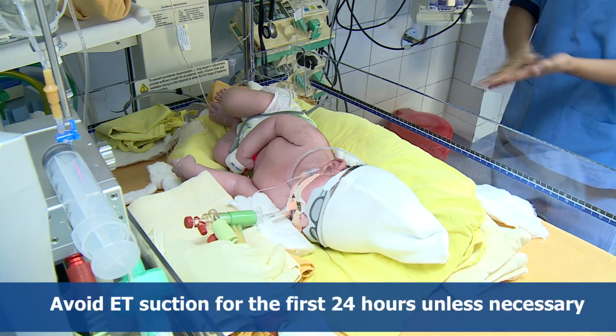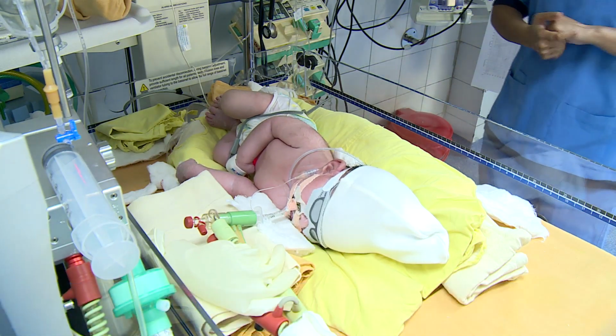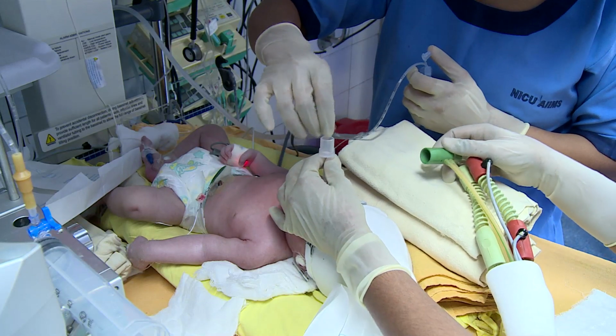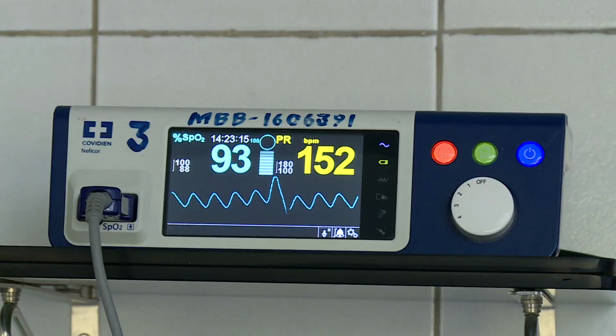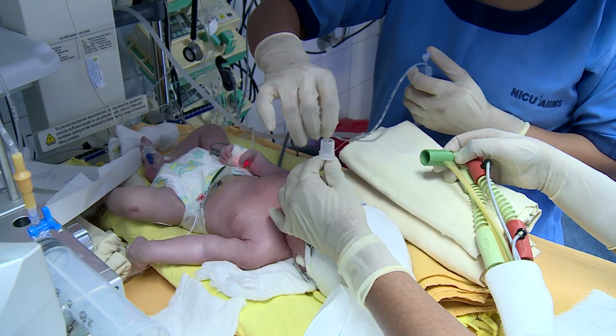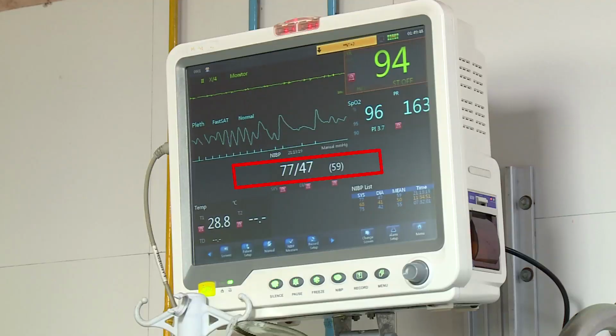Avoid ET suction for the first 24 hours unless necessary, and it is to be done only if there is evidence of tube block, such as desaturation or decrease in wiggle of the chest. Watch for any desaturation noticed soon after suction and record action taken for the same, such as an increase in MAP or FiO2. Be prepared for a potential drop in blood pressure, which can occur due to increased intrathoracic pressure. Volume expanders and or inotropes should be ready.